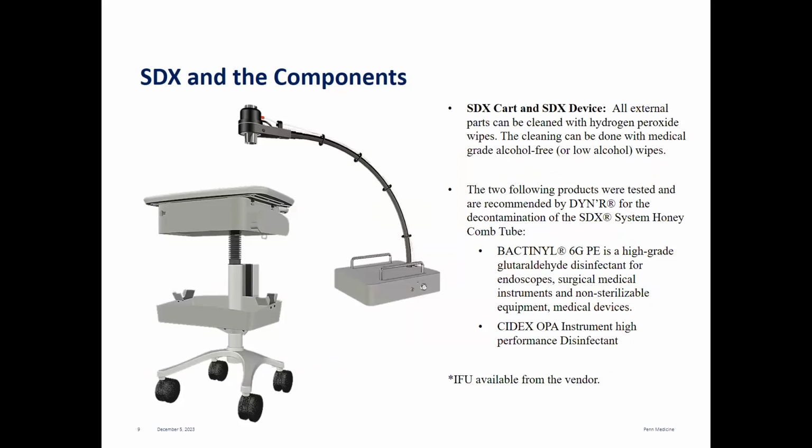So this slide shows the SDX cart and the device itself. At Penn Medicine, we clean the external parts with hydrogen peroxide wipes. The cleaning can also be done with medical grade alcohol-free or low alcohol wipes. The two products mentioned on this slide were tested and recommended by the manufacturer for the decontamination of the honeycomb. You can also look up the IFU that's available from the vendor.